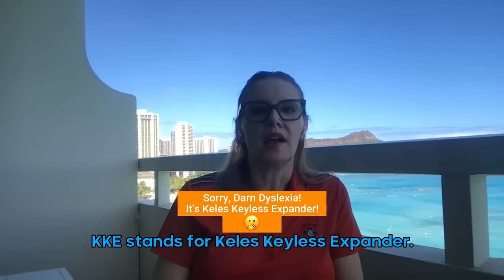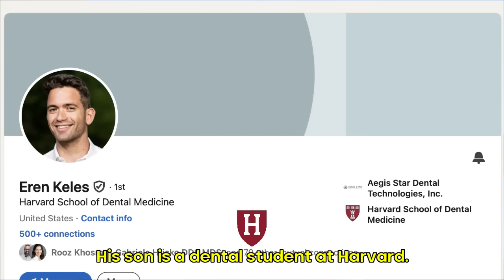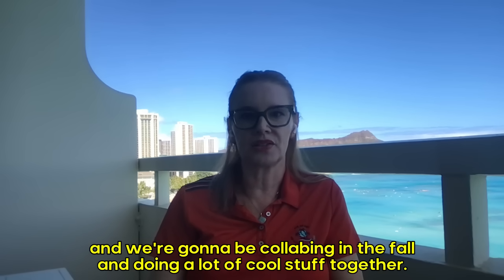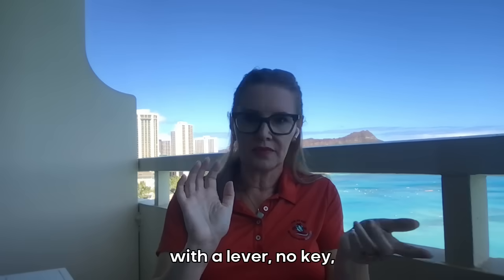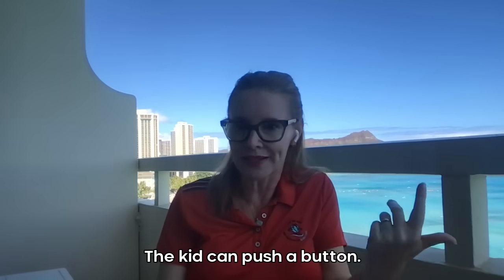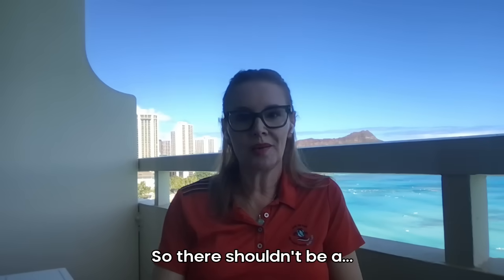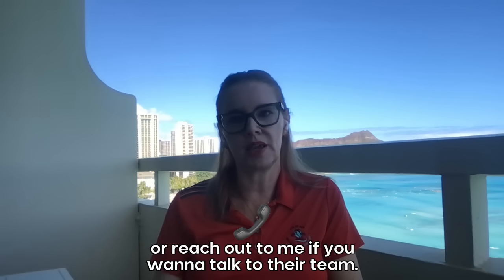But there is a middle option — look up my KKE expander. The KKE stands for Keles Keyless Expander. Dr. Keles was one of my professors, and we're really good friends with the family. We're going to be collaborating in the fall and doing a lot of cool stuff together. The KKE expander is 3D printed with a lever — no key, just a button. There's nobody who cannot push a button. A dog can push a button, a cat can push a button, the kid can push a button. So take a look at the KKE. It is more like the regular price of an expander — not like a $700 expander. Look at my YouTube channel under KKE, or reach out to me if you want to talk to their team.